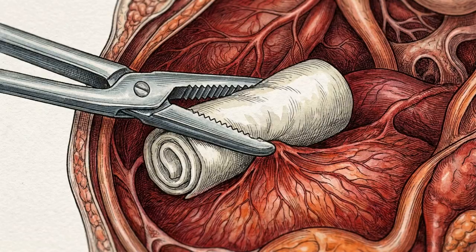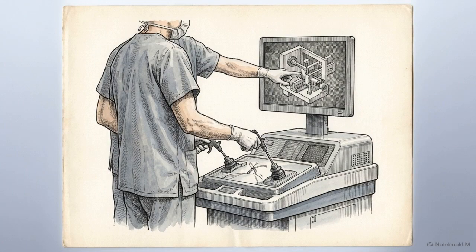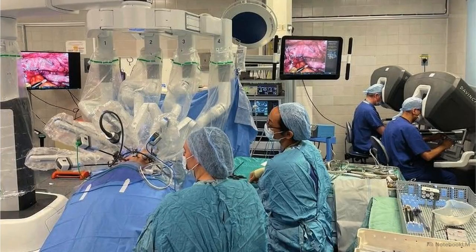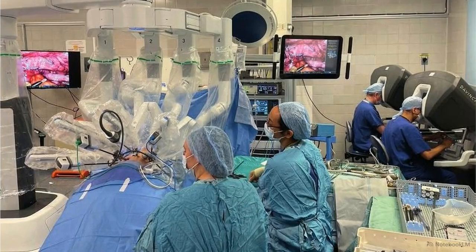Standard minimal access surgery protects the patient from external trauma, but the resulting cognitive load and spatial distortion demand a level of coordination only attained through specialized simulation and mentoring. Robotic telemanipulation was developed as a master-slave interface to bridge the sensory and motor gaps created by standard laparoscopy. The system is built on physical separation. The surgeon sits at a remote console, removed from the sterile field, controlling the robotic arms through a digital hub.